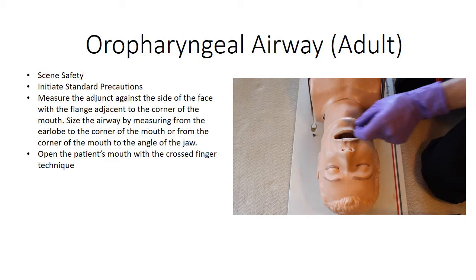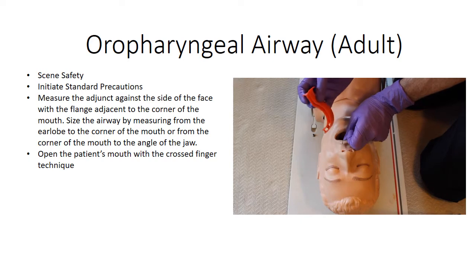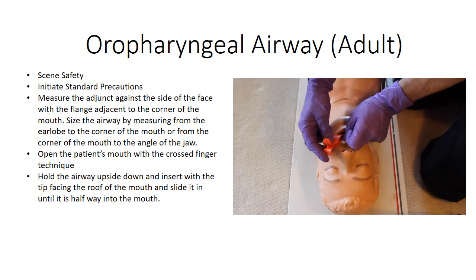Open the patient's mouth with the cross finger technique. Hold the airway upside down with your other hand. Insert the airway with the tip facing the roof of the mouth and slide it in until it is halfway into the mouth.